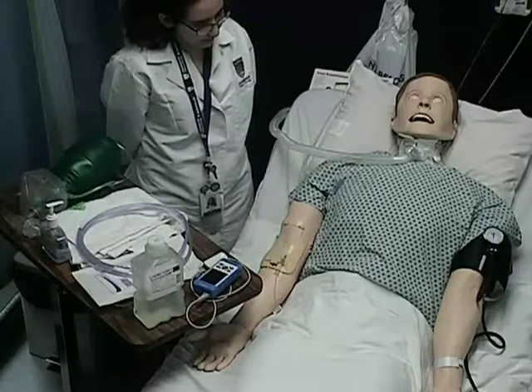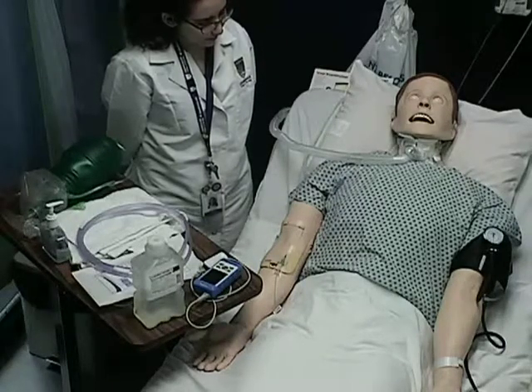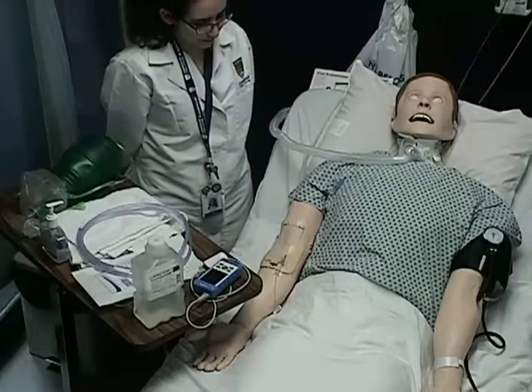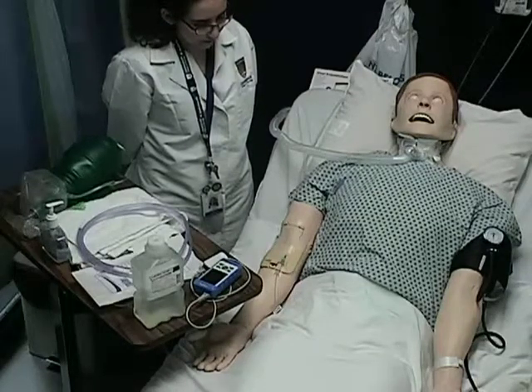Encourage patient to cough out secretions. Explain importance of coughing during procedure. Assist patient into appropriate position.